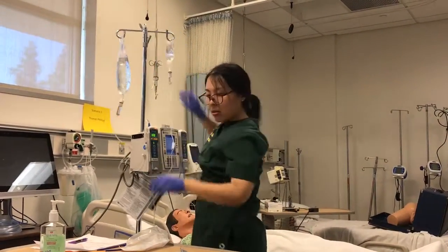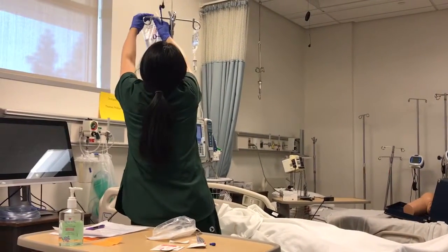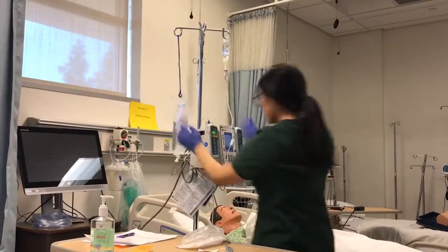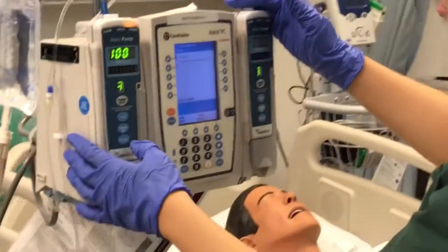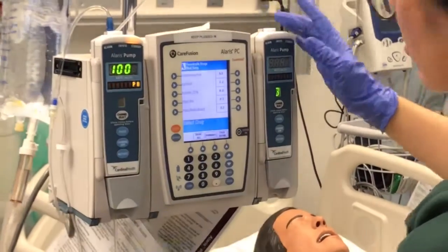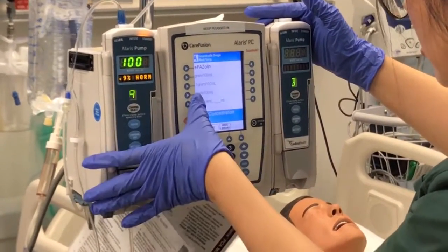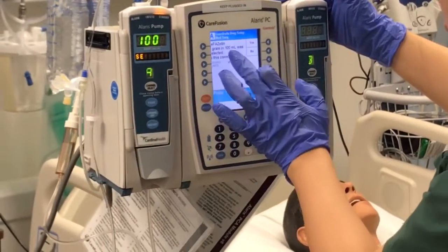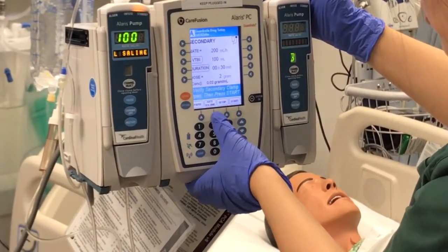I'll go ahead and hang it here and use this one. Go ahead and lower the primary bag. After all these, I'm going to program the secondary bag. Go to channel selection first, then secondary, then choose the medication, which is cefazolin. Then the medication is 2 grams in 100 ml. So confirm here, go to the next, and set up the rate and volume here.